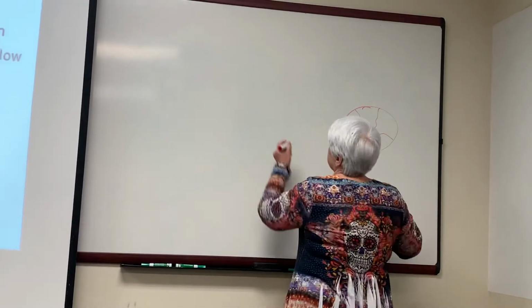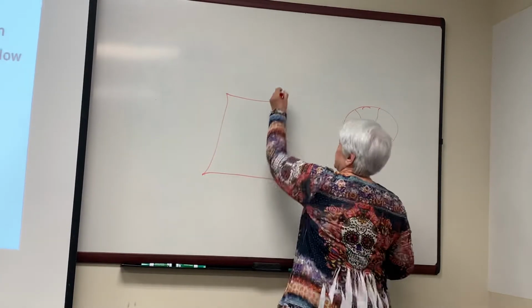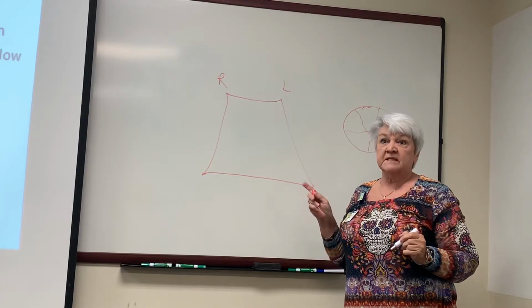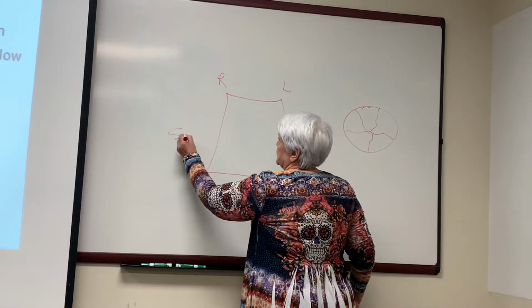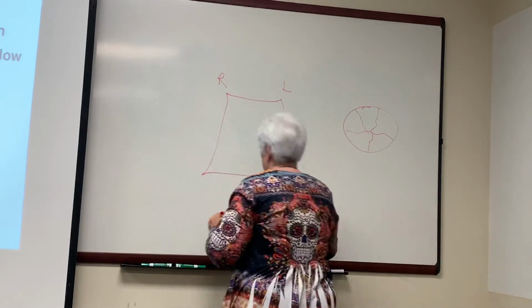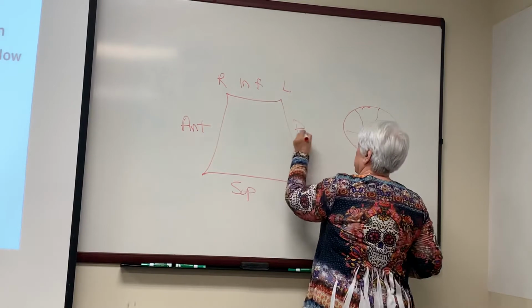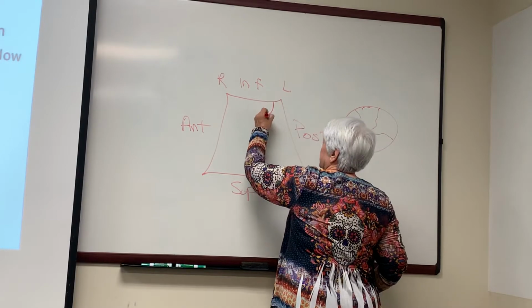Okay. So here's my screen. This is the left. This is the right. Okay? So if I'm transvaginal, not transabdominal, transvaginal, this is superior. This is inferior, superior, anterior, posterior. Okay? So when we see it, it's going to come like this.